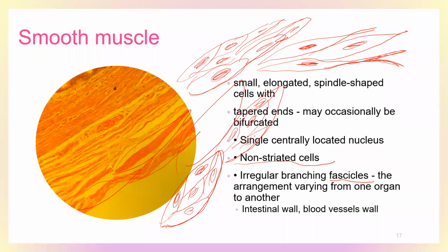Again, you will get this in the lecture also. Muscle fascicles are actually groups of cells, so you might say fascicle for skeletal muscle also, though not usually for cardiac. Smooth muscle also has small groups of muscles. You see a layer of smooth muscle, and within that layer you see the groups divided into small areas like that. Inside them you get all the smooth muscle cells, so cells are arranged into fascicles.